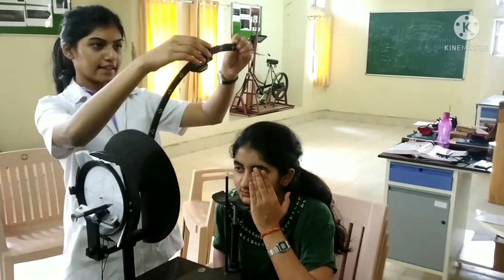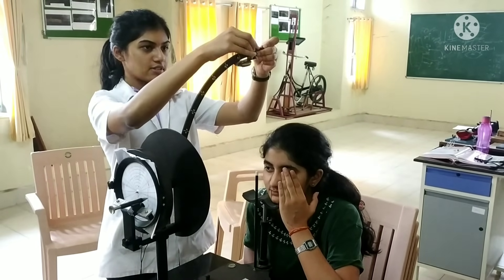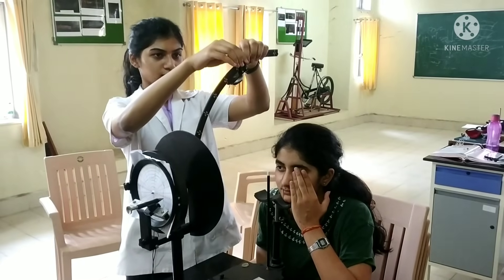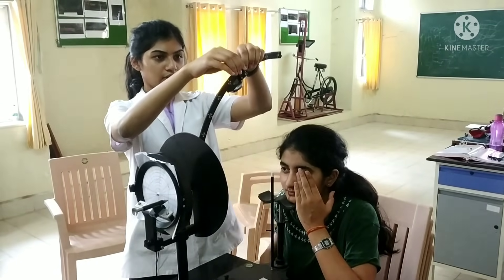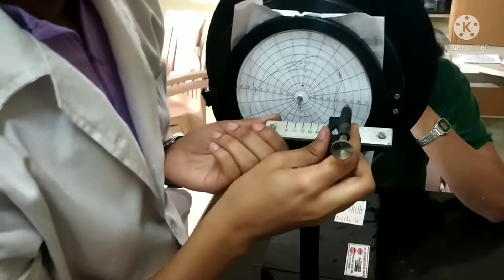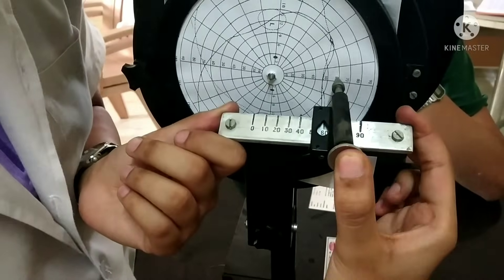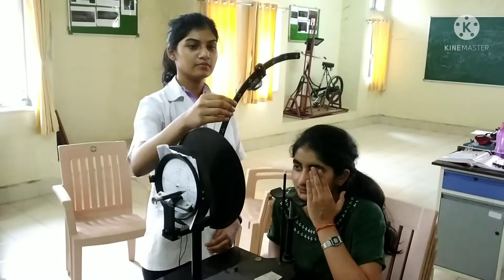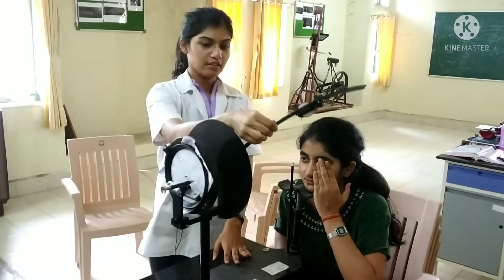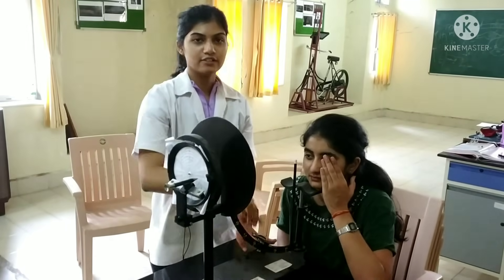Now this is the superior side. The subject raises her hand when able to see the object, and the reading here is 60. We mark 60 on the chart. The same procedure is repeated at 15-degree intervals to get readings for the nasal side and then for the inferior side.